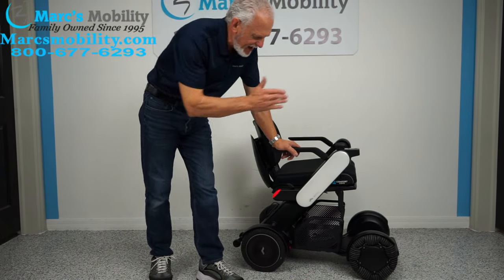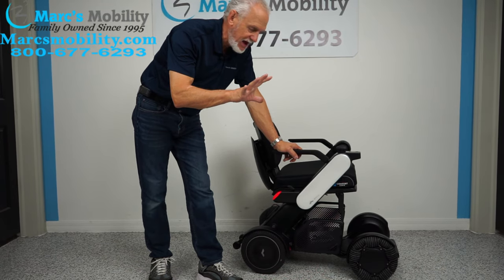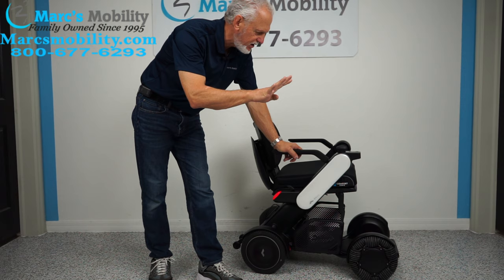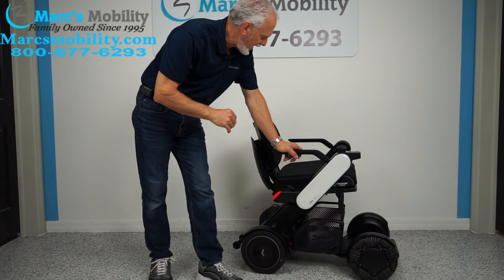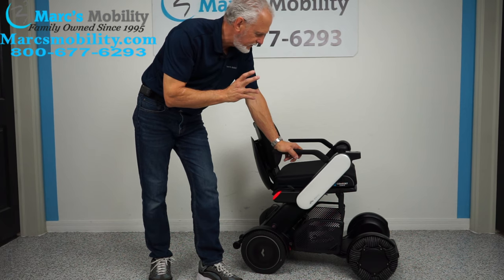This chair is about 39 inches long. The top speed of this power chair is 5 miles an hour — it has 4 speed settings. Now we're going to look at how to take this chair apart for transportation.